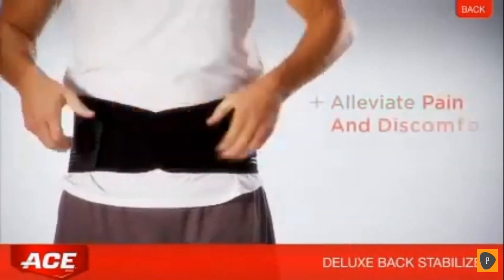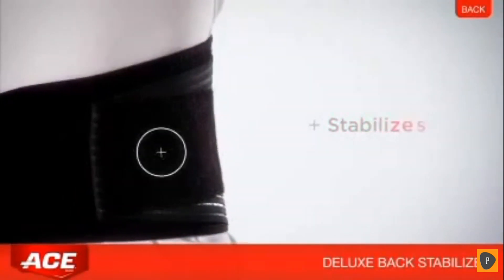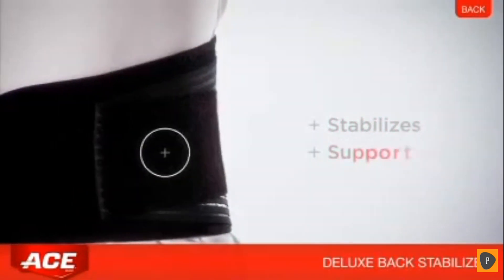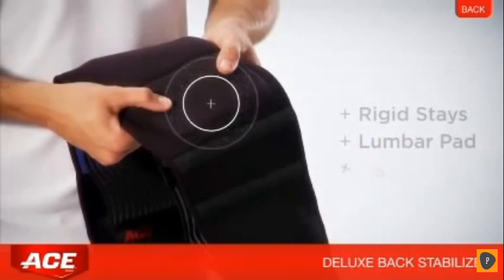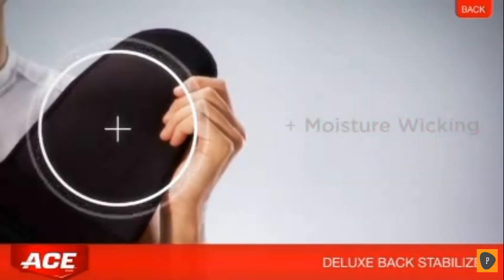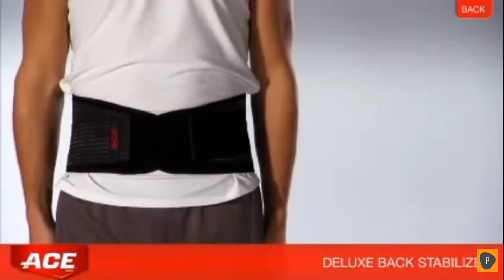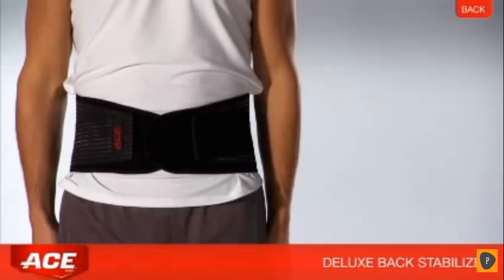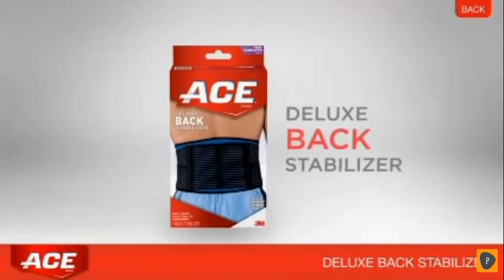The Deluxe Back Stabilizer helps alleviate pain and discomfort in the lower back and abdominal muscles. A dual strap system stabilizes the lower back and supports abdominal muscles, while rigid stays and a lumbar pad provide additional support. Moisture wicking material keeps the skin surface dry and cool, providing adjustable compression and support while maintaining comfort with breathable materials.